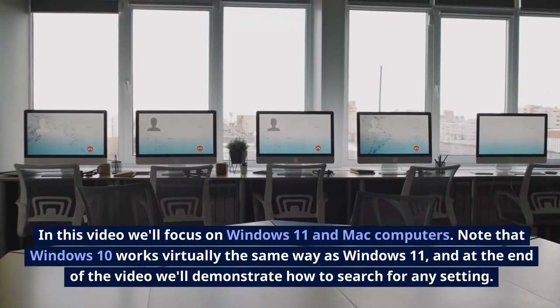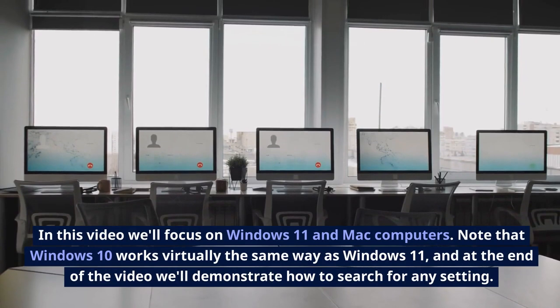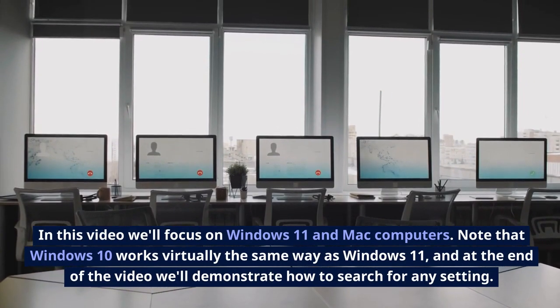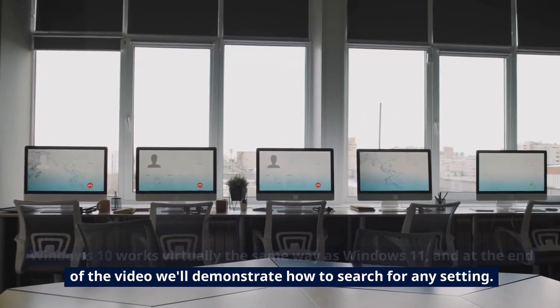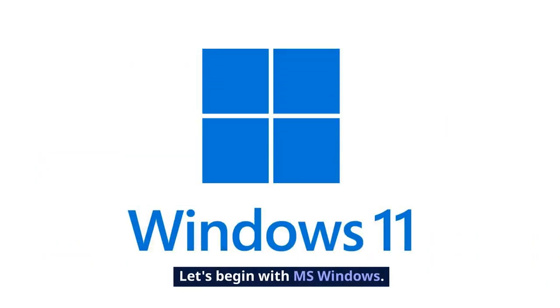Note that Windows 10 works virtually the same way as Windows 11, and at the end of the video we'll demonstrate how to search for any setting. Let's begin with MS Windows.